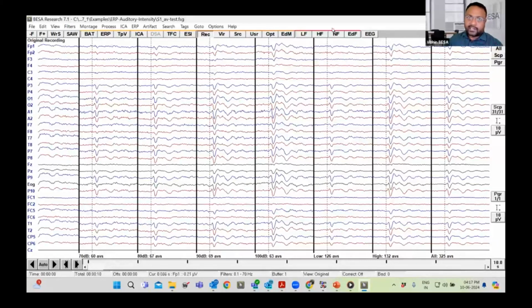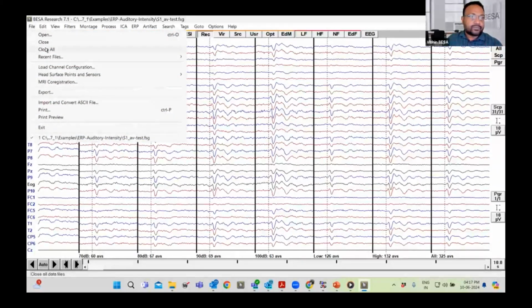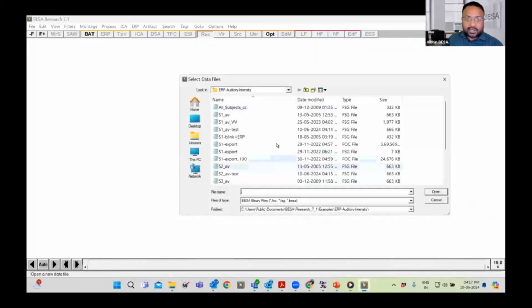Are there any questions over here? Please do ask. Let me just close this file. Similarly, we also have the second file, S2 average.